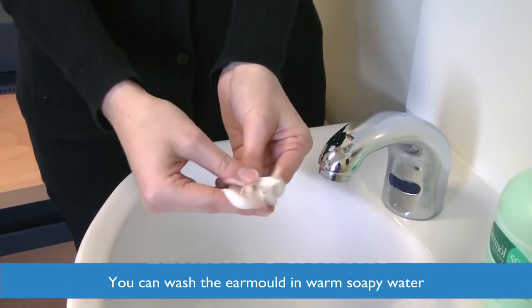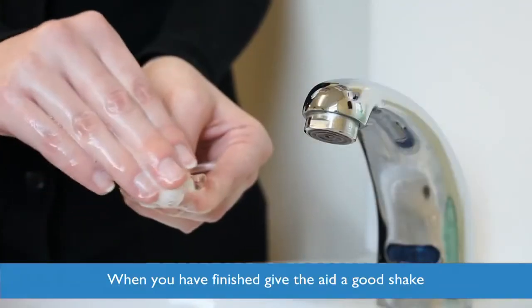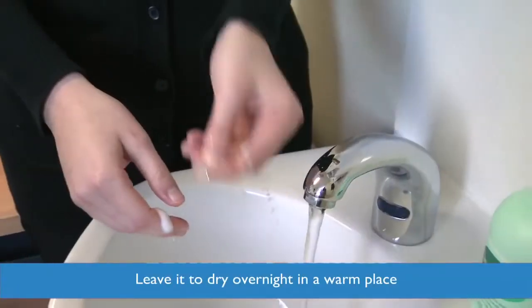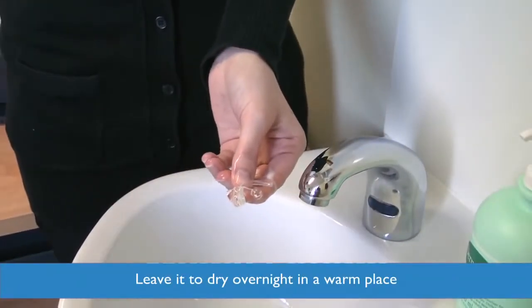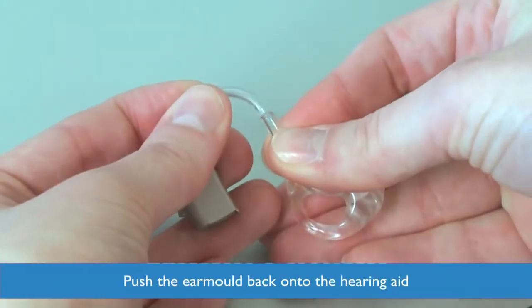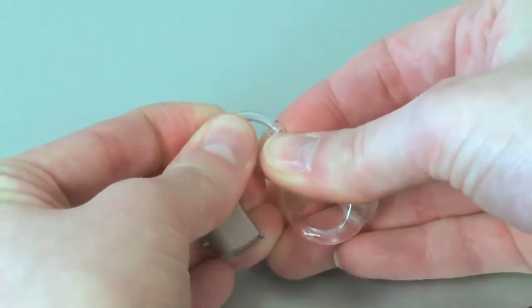You can wash the ear mold in warm soapy water. Just remember when you have finished to give it a good shake and perhaps wash it in the evening and leave it somewhere warm to dry overnight. Then, when you have finished, just push the ear mold back onto the hearing aid.